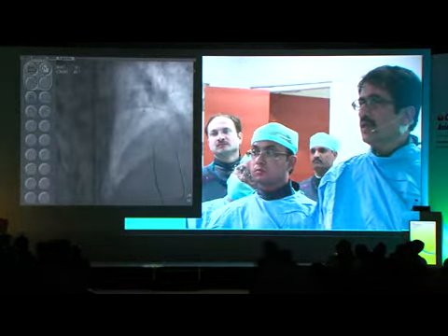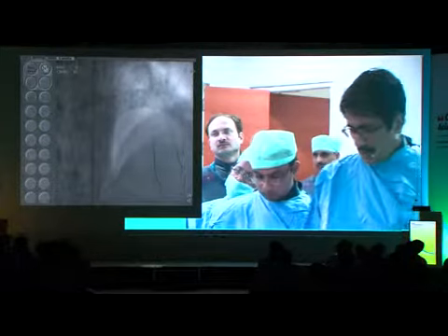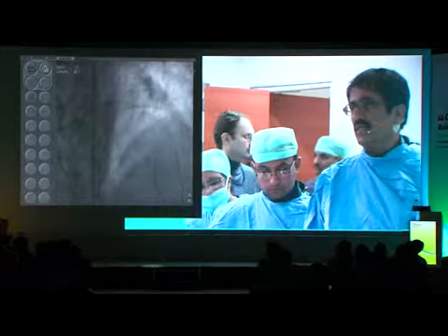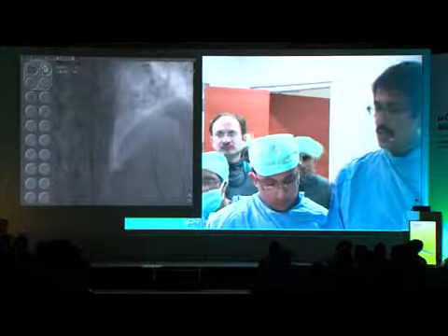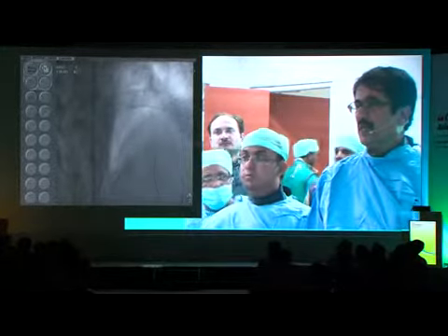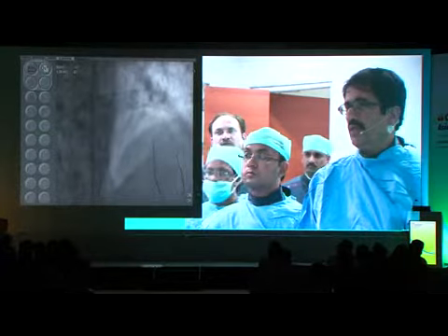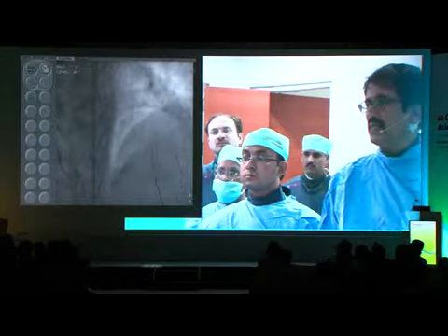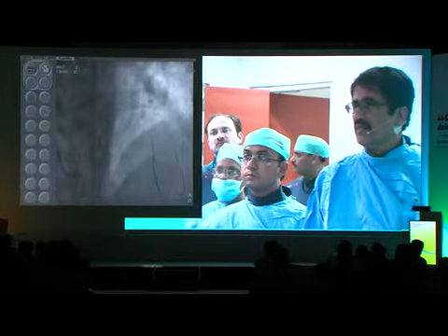This is an NC balloon to dilate the side branch in case we had not dilated adequately. So there are 2 things. One is preparing a bed, which should be very adequate, which we are doing again here. And second is the wires getting entangled and the stent not able to advance.